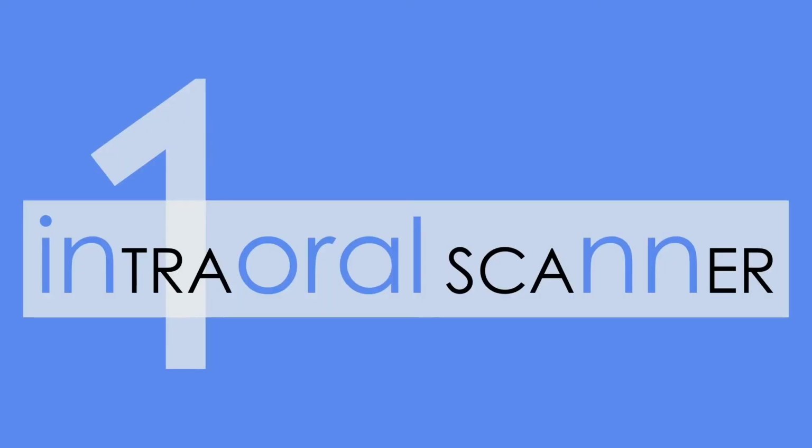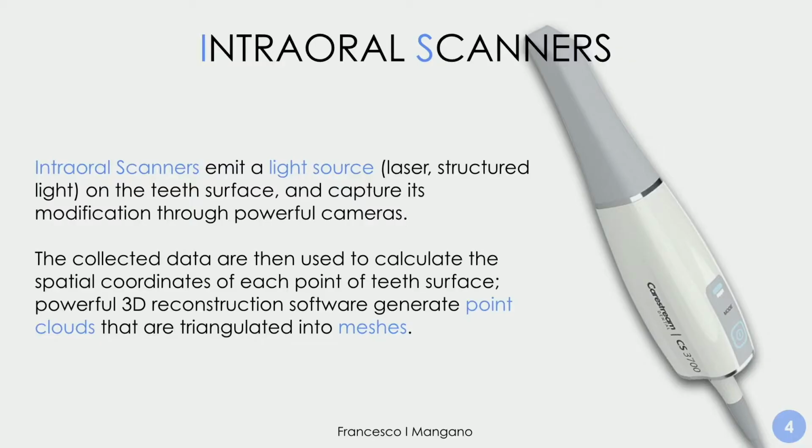So this is the number one factor to be considered when capturing a full arch implant impression. And we need to go back to the basics, because the intraoral scanner works by emitting a source of light, usually a structured light grid or pattern, or laser. Then this grid, this pattern of light undergoes deformation, because when we emit this source of light, the light impacts on the scan bodies and the model, and this deformation is captured by the cameras of the intraoral scanner.